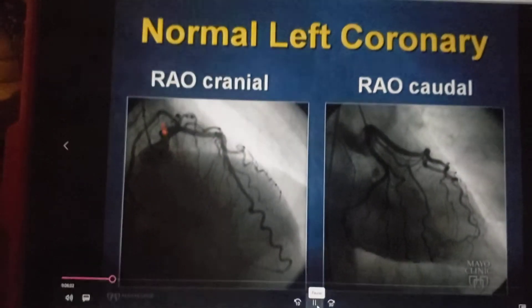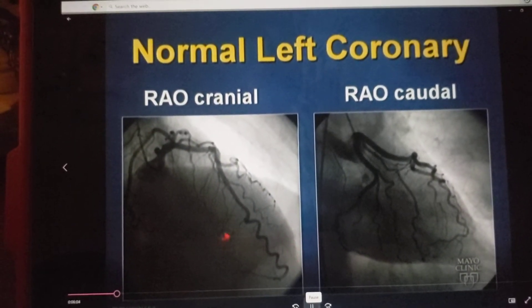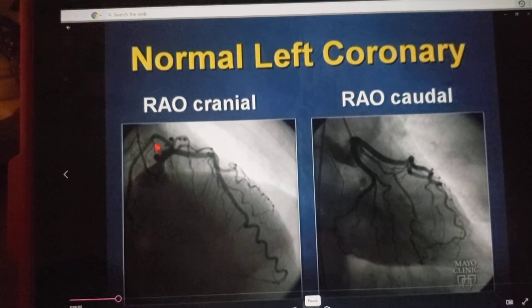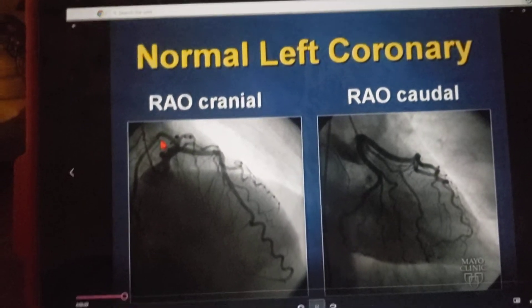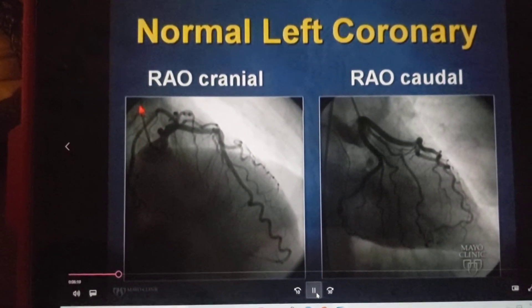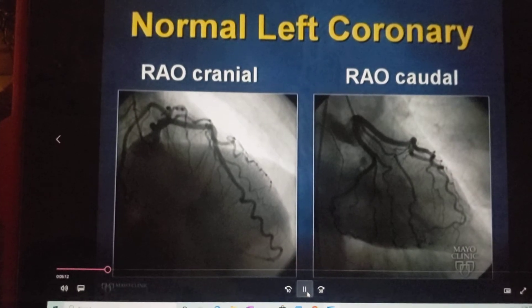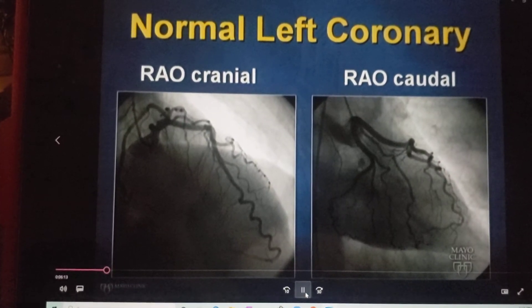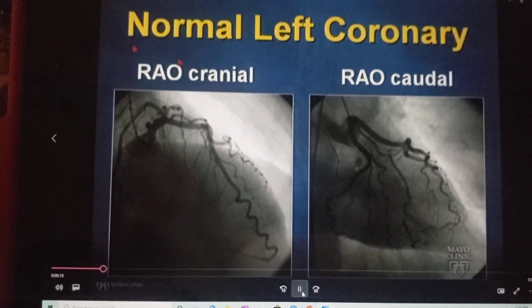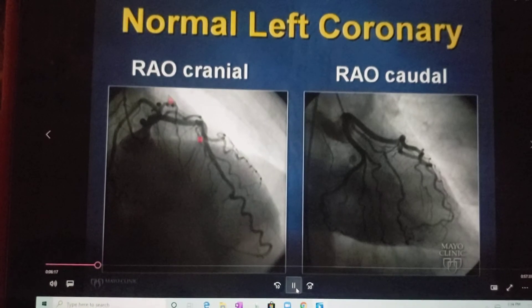Coronary artery — ribs going down on the right, spine is on the left. If you can't see the spine, remember that the catheter typically will follow the course of the aorta, which lies against the spine, and thus will be posterior. So the spine here is on the left side of the patient, ribs going down on the right.